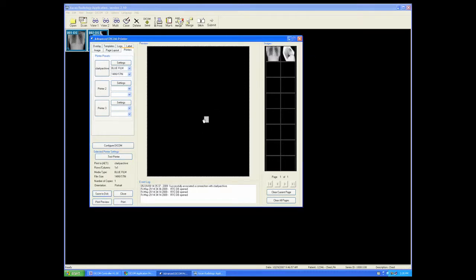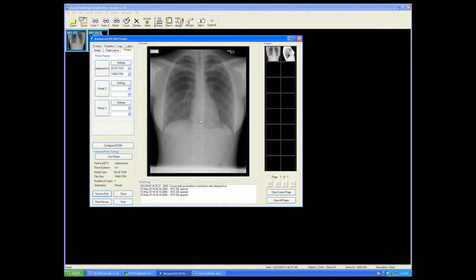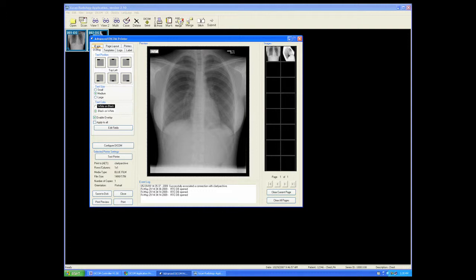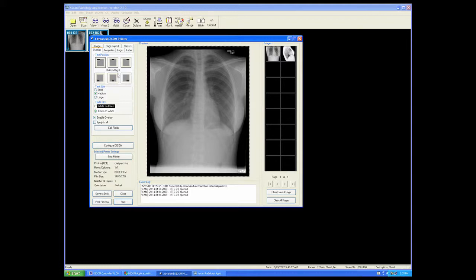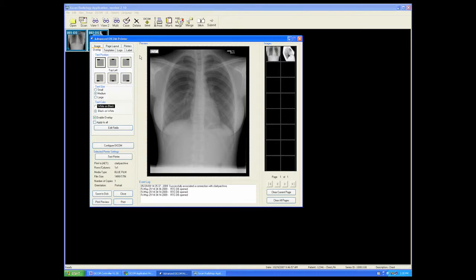From here, we can edit the overlay for the patient demographics. We can change where the overlay will lay or drop on the image. We can change the color of the overlay from black text on a white background to white text on a black background.